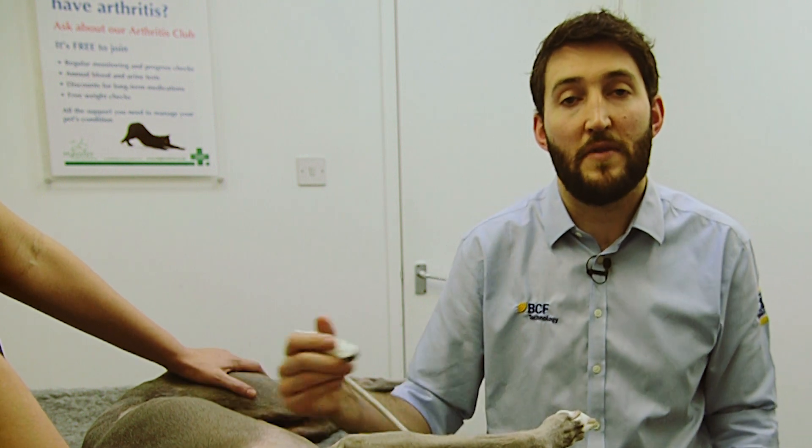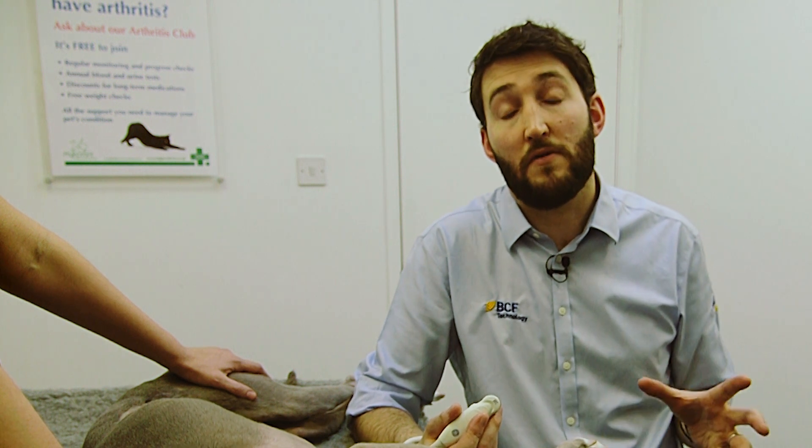In this video we're going to look at how to scan the left limb of the pancreas. It's worth bearing in mind that scanning the left limb of the pancreas in the dog is actually rather more tricky than scanning the same part of the pancreas in the cat.